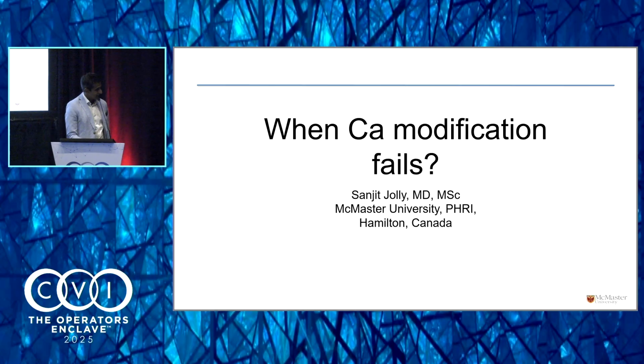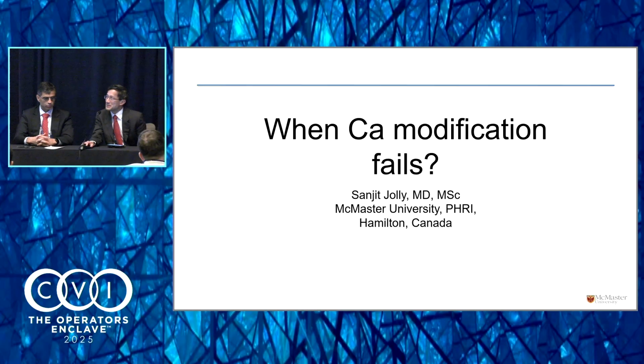Question about the perforation, because I think that's on the mind of many operators. I mean, is it safer for the OPN balloon because of the double layer design, the lack of puncture and perforation of the balloon to avoid coronary perforation, or is it still a risk because of potentially oversizing and pushing out a nodule out the vessel?